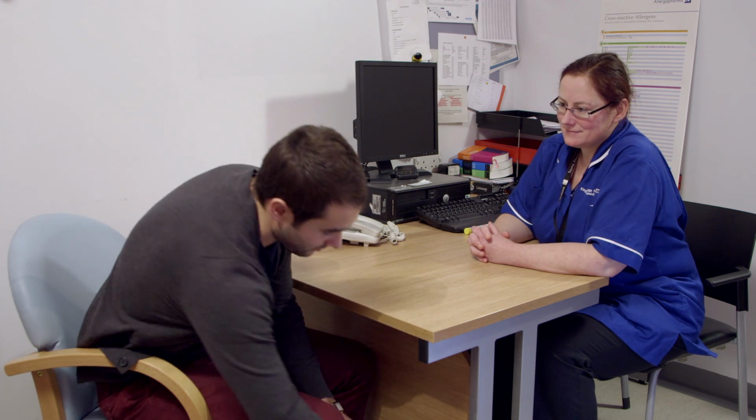Okay, we brought you in here to review your anaphylaxis kit, which should contain 2 Jext, antihistamine tablets, and your asthma spray, if you've got asthma. Yeah, I've got it here in my bag. It's quite big, so I have to remember to take it everywhere I go. It is very important that you take it with you at all times. You never know when you're going to have an anaphylactic episode.